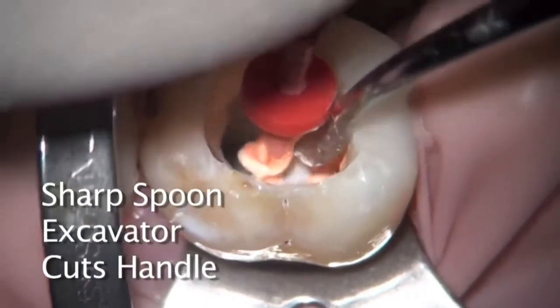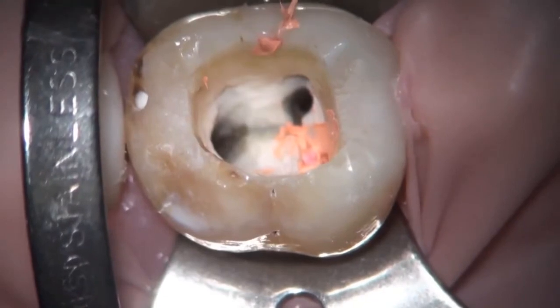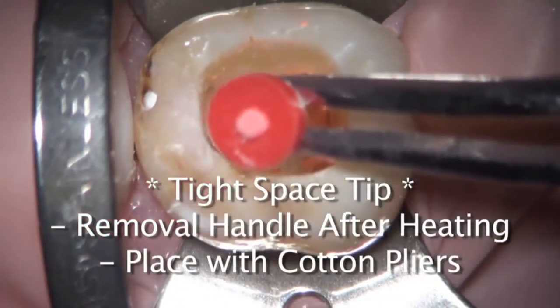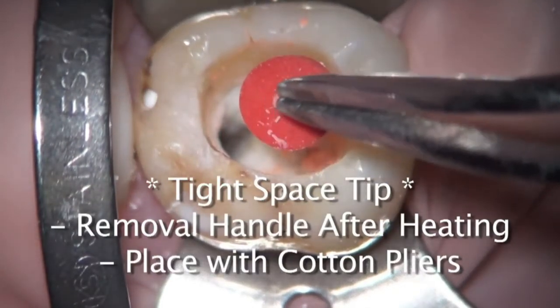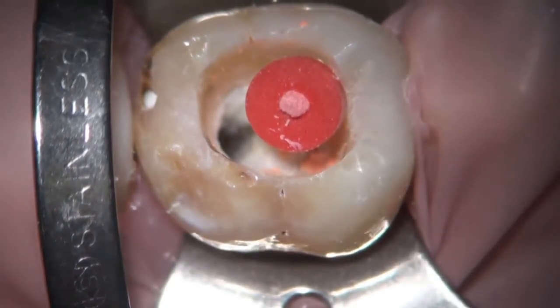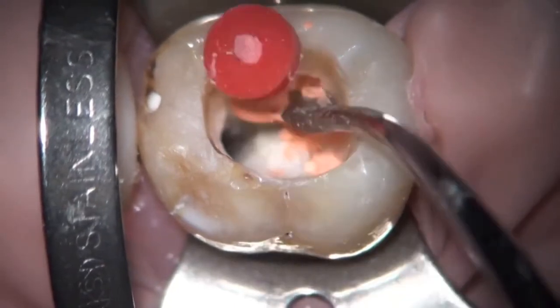This makes it a little bit easier to prevent any blockage. You can see this one being placed with cotton pliers, facilitating access — that is my method of choice. When it comes out of the oven, I'll grab it with the cotton pliers, break the handle, and place it this way. It provides just the extra few millimeters of access so the handle isn't getting in the way. The carrier is then being severed with a sharp spoon.